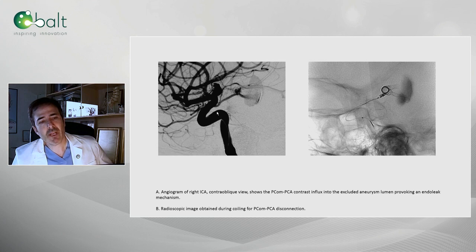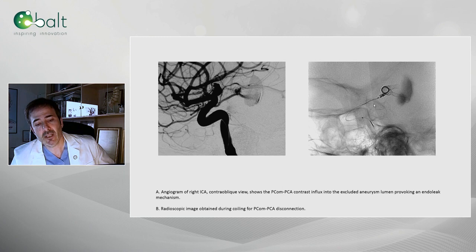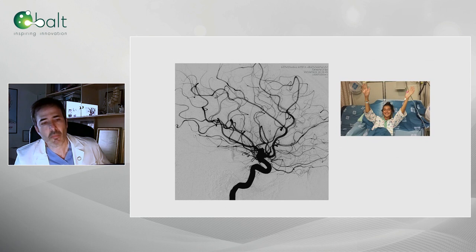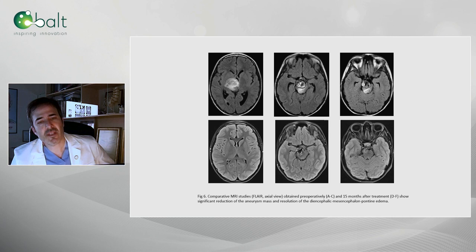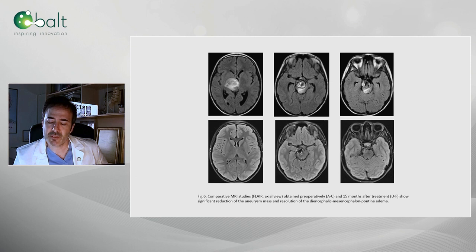Then we go through the carotid. You see the PCOM-PCA influx into the already excluded aneurysm lumen, provoking an endo leak mechanism that we treat by doing disconnection of this PCOM-PCA. This is the immediate post. This is the MRI obtained before the intervention and after 15 months of the intervention. This treatment can only be done with these new micro flow diverters.